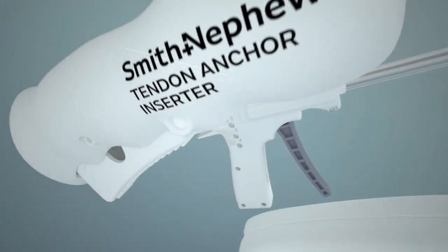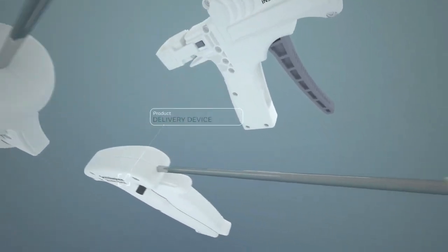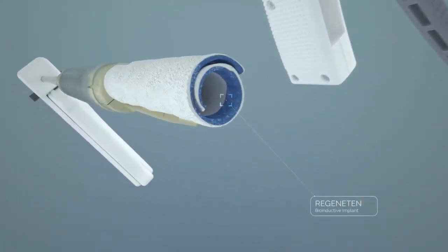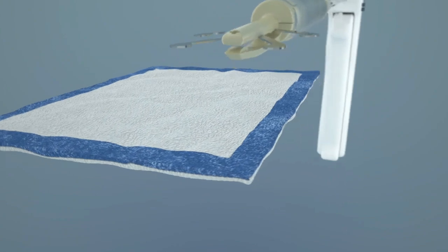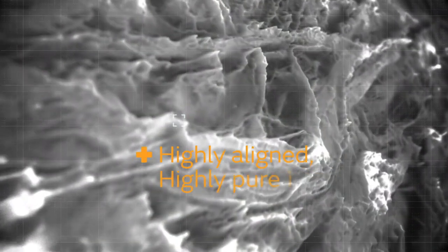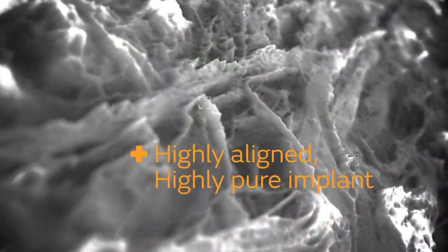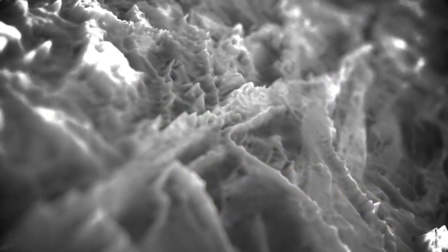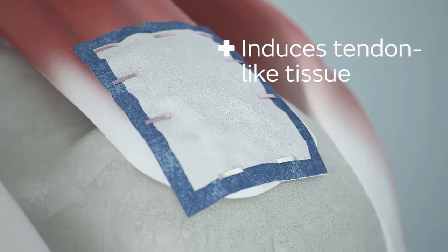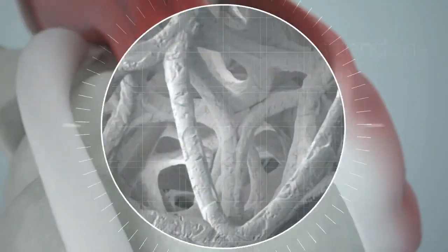we use special techniques to insert the bovine bioinductive patch through a special inserter. The patch comes in two sizes and is a pure implant made of collagen. It induces tendon-like tissue.